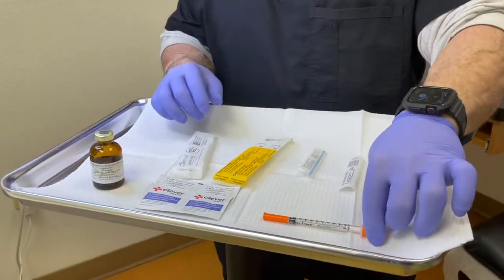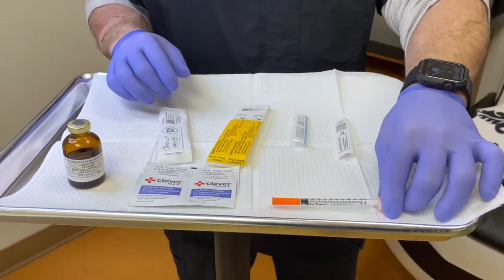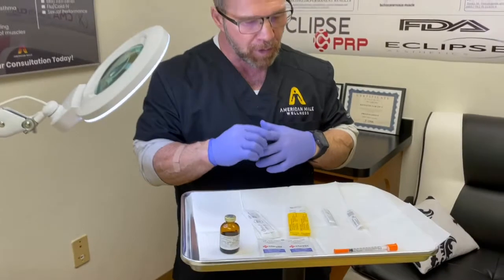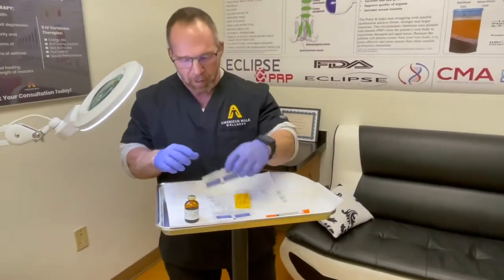At the end I'm going to go over what you shouldn't do — specifically why you shouldn't use an insulin syringe for testosterone. I know that's common out there, but I'd like to show you why you shouldn't do that.